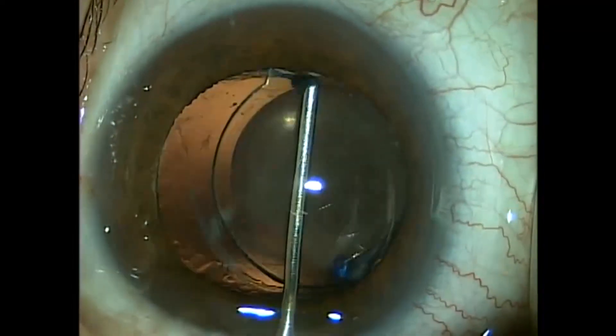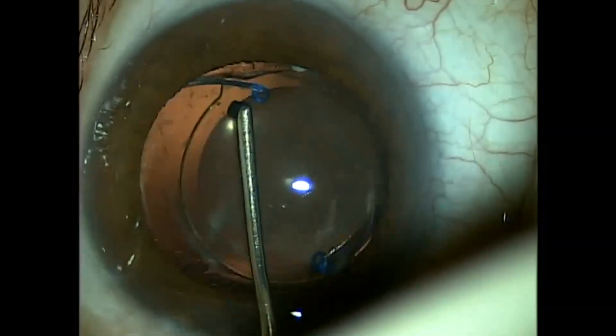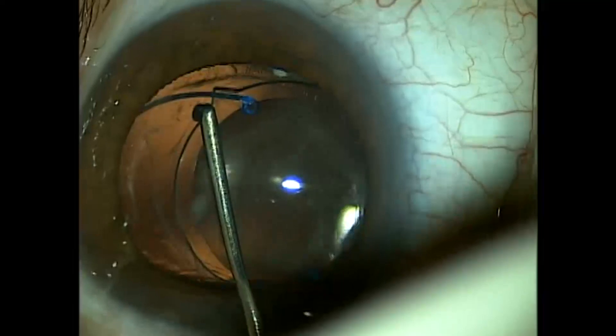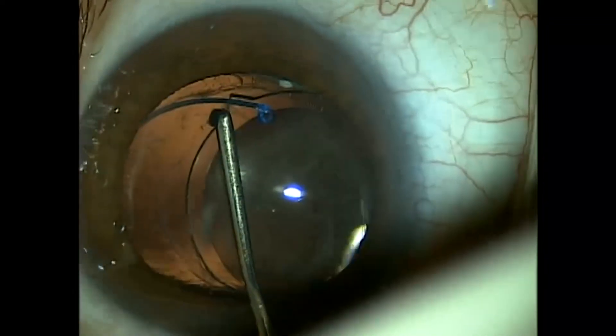He's now seven years after cataract surgery with this lens implant. Because these haptics are smooth, a lot of times we can just free the adhesions to the haptics and spin the lens out of the capsular bag. And that was the plan here.